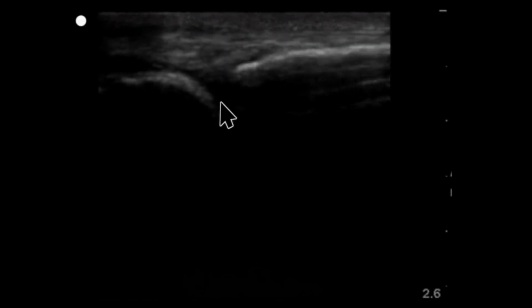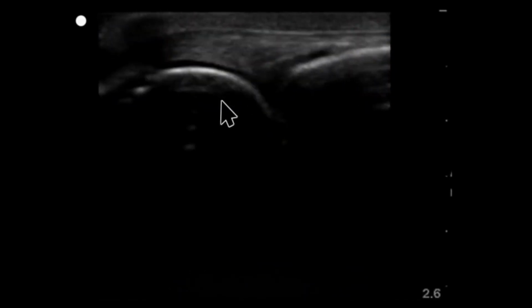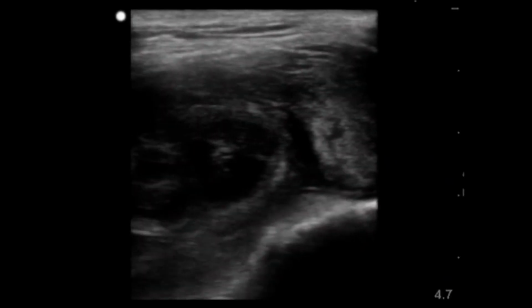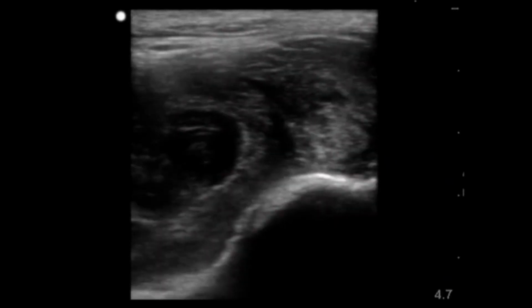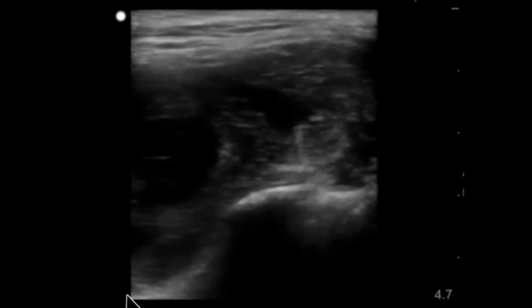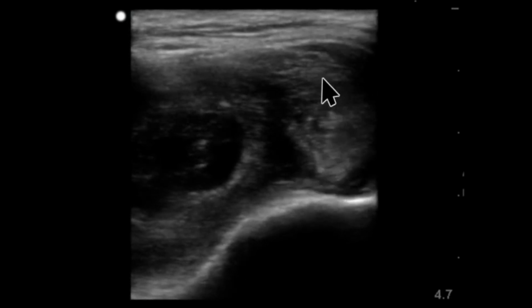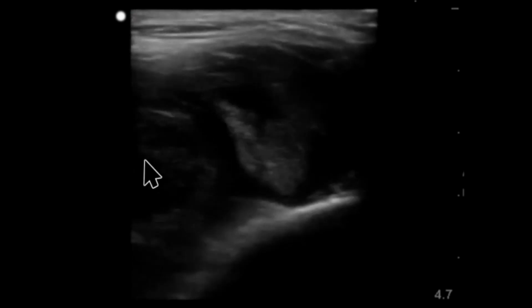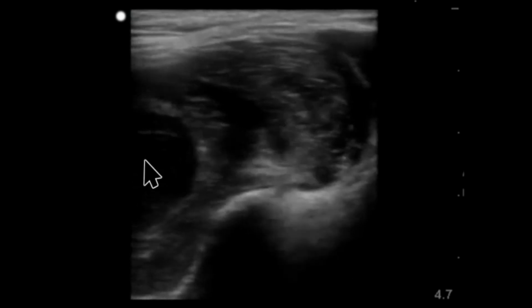One wing of a seagull here, another wing over here, as we see these two bones articulate with one another. Now this patient, here's this lumbar spine here, and we can make out the psoas muscle here, but adjacent to that psoas is all this hematoma formation here. So this is a psoas hematoma.